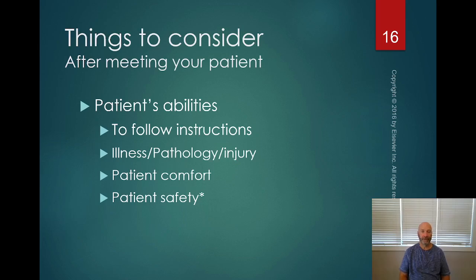Also, consider the pathologies that we may potentially be looking at. You read your request and you see something like pleural effusion, and what you're doing is a chest x-ray, and the patient can't stand up because they're so sick. So you might want to check with the doctor and offer the doctor some options in order to visualize that pleural effusion.